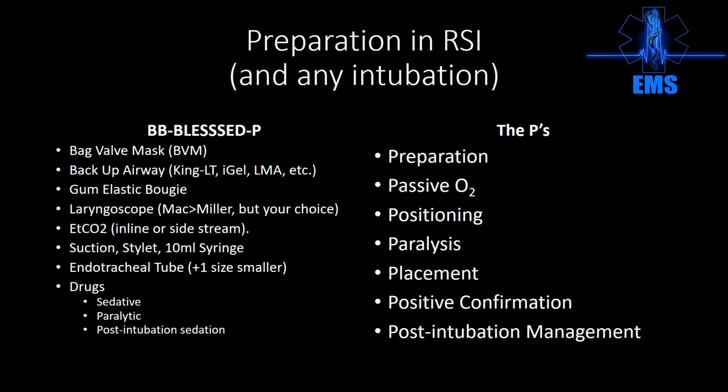So as soon as you stick the blade in the mouth, that's an attempt. Once we've intubated the patient, we need positive confirmation. You guys need 2 forms of positive confirmation in order to say that that tube is where it's supposed to be. The best and most universally accepted is end-tidal CO2 with a graph readout. So we're looking for the mesa, right? We're looking for the plateau, followed by the drop-off, followed by the sharp incursion, followed by the plateau.